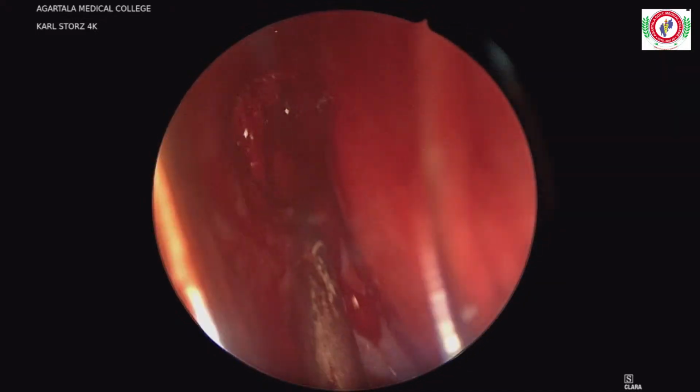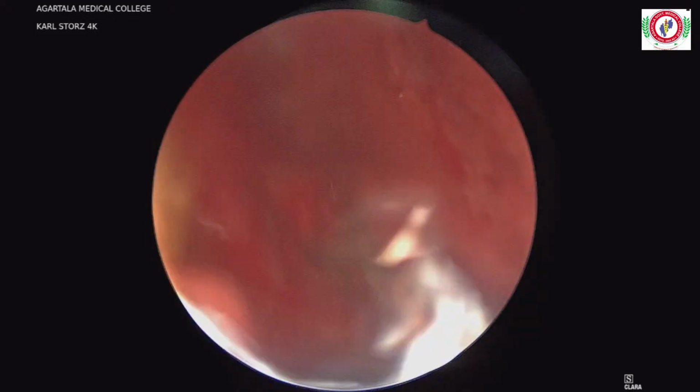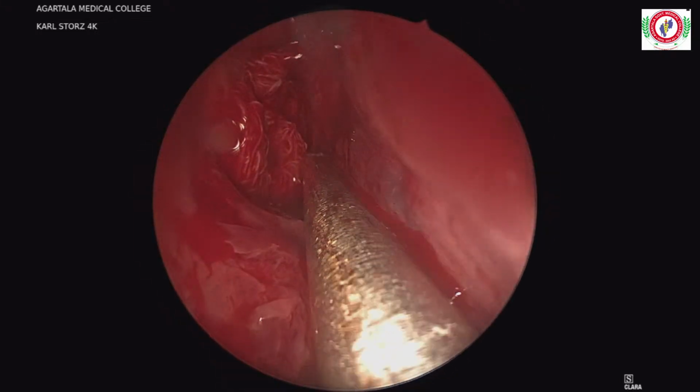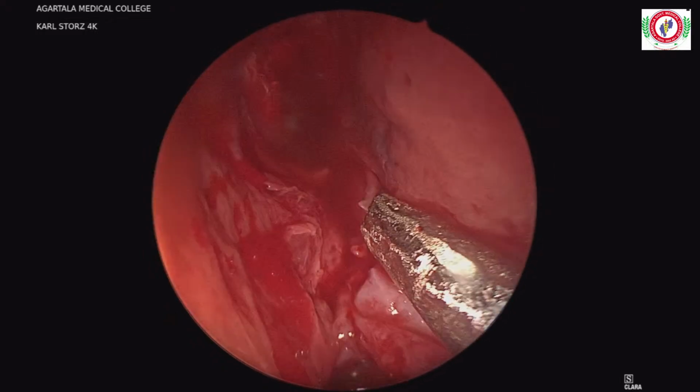Washes, yes, give me wash. Yes, washes are always helpful. So that is why I have packed a little and I am doing my septoplasty work, so that by that time I'll have a good BP and this bleeding will be taken care of, okay?